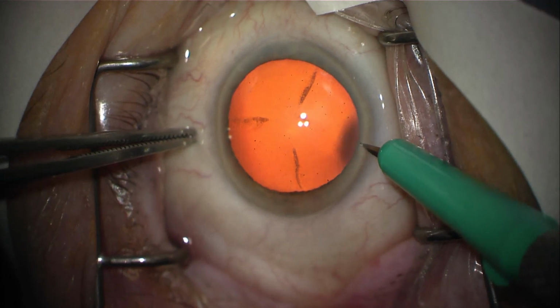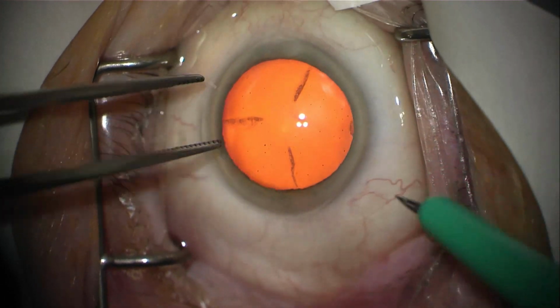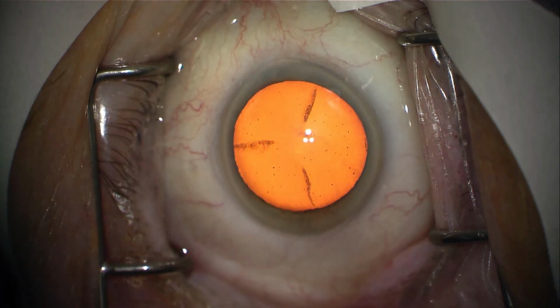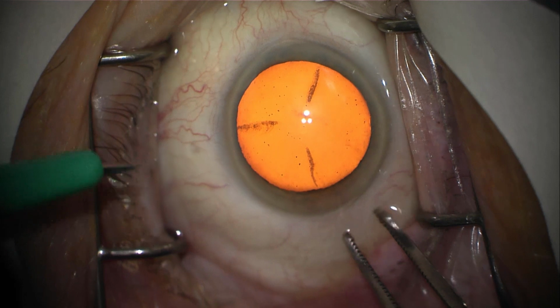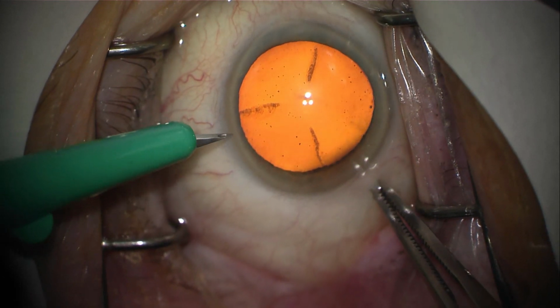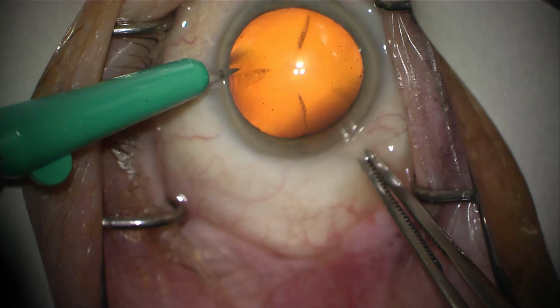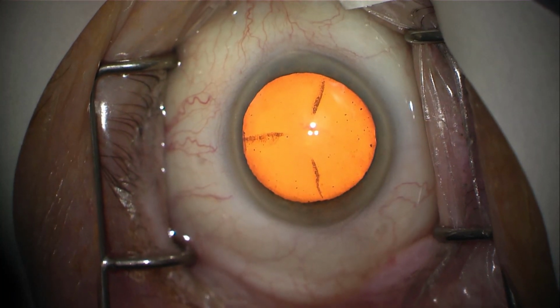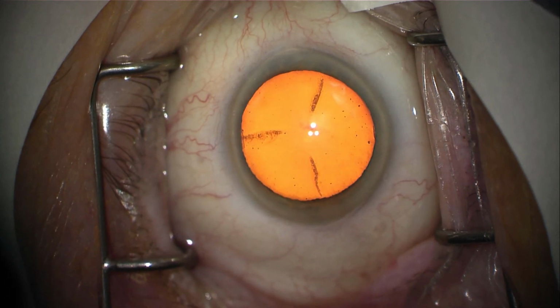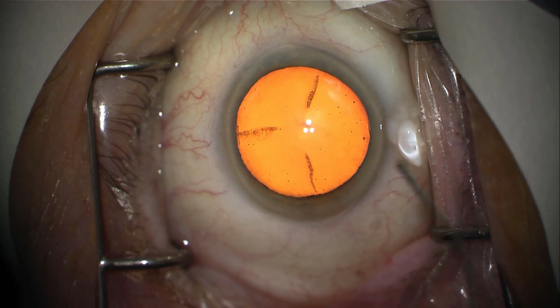Now, if you're squeamish, don't watch this because I'm about to put in a 1mm blade into the cornea on the bottom of the eye and also on the top of the eye. This is known as a paracentesis incision. It's approximately 1mm wide and allows me access into the eye during the surgery later on in the case. You can see that the patient is awake and moving their eye.